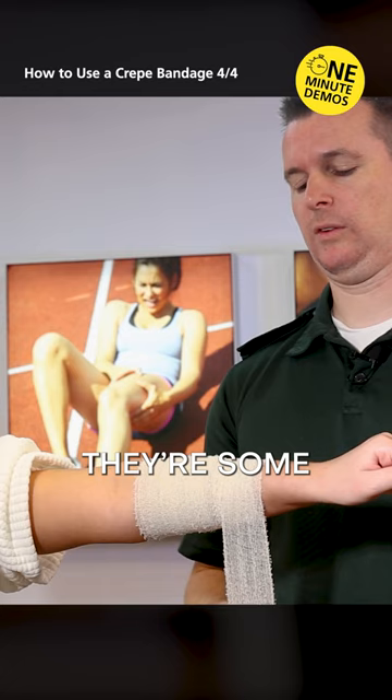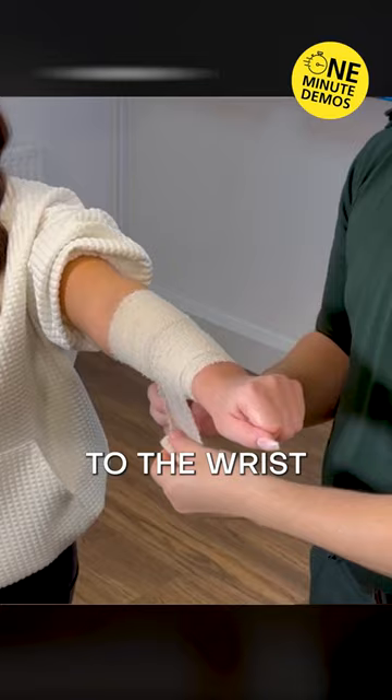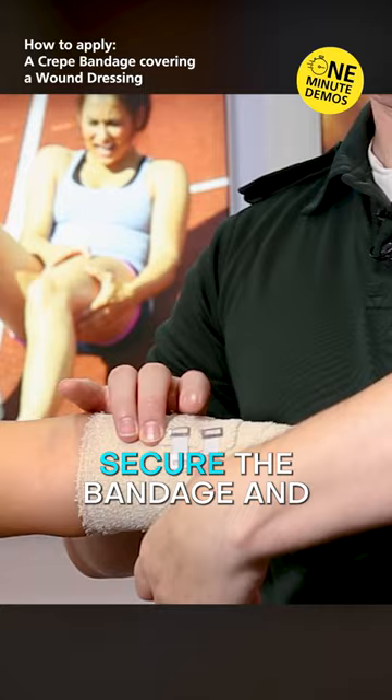Coming back over the wound, applying some pressure and tension in the bandage. There are some different methods. Some people will overlap the wound and come a bandage width either side. Some methods are to do joint to joint. I'm going down to the wrist and then we're going to work our way back up.